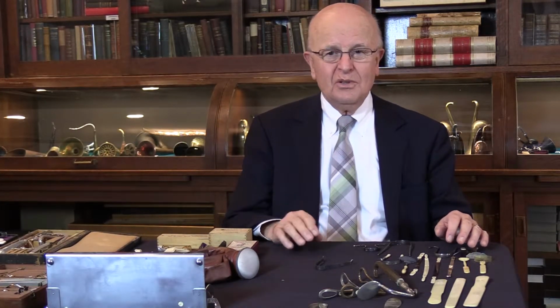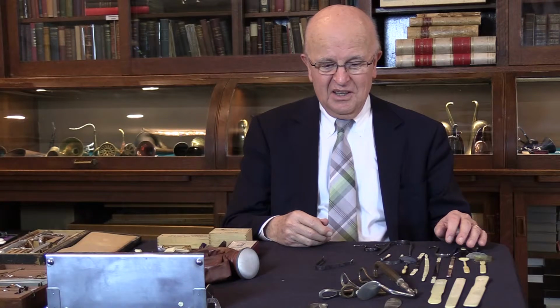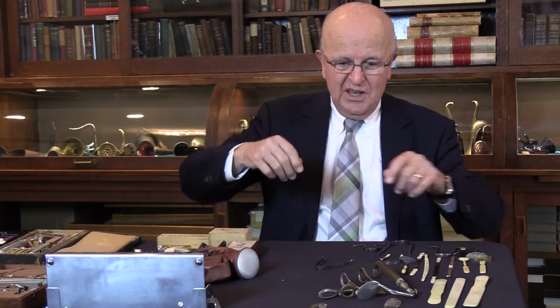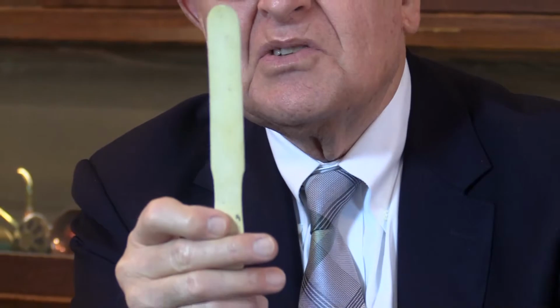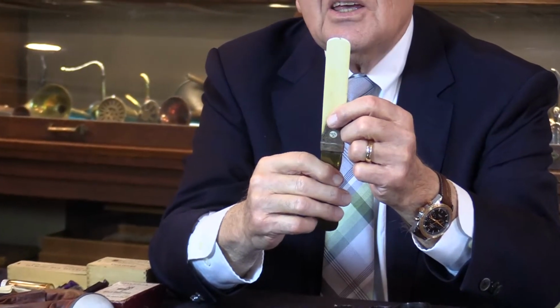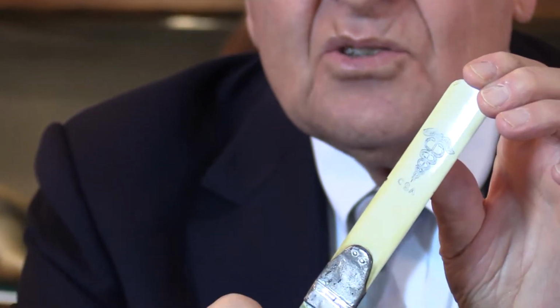The simple thing we do now to look in the throat is to use a disposable wooden tongue depressor, throw it in the garbage. But to get to this point, there was at least a century of development of tongue blades, which I want to share some examples of. So the earliest tongue blades are pure ivory, and these are some examples of the ivory tongue blades. Some of them are thin, some are thicker. This is a very interesting tongue blade, and it is CSA, and it has the caduceus here, and this is silver. Again, this is also ivory.